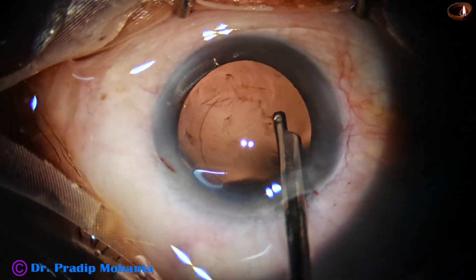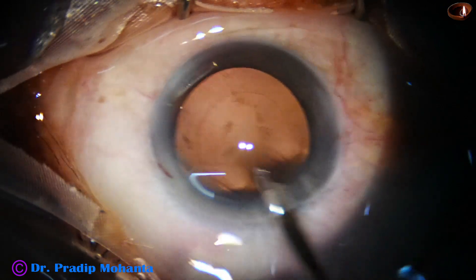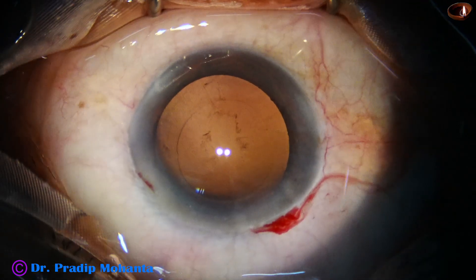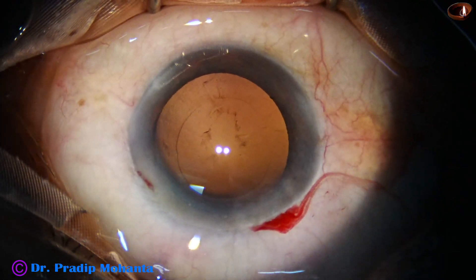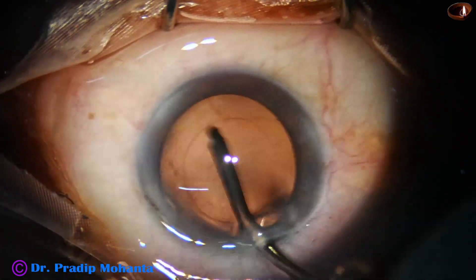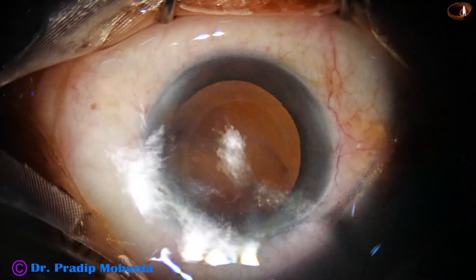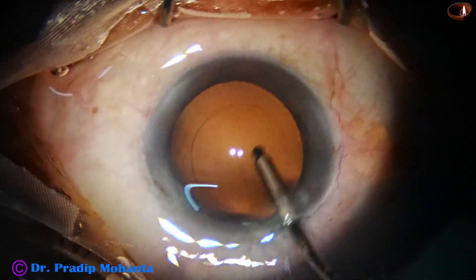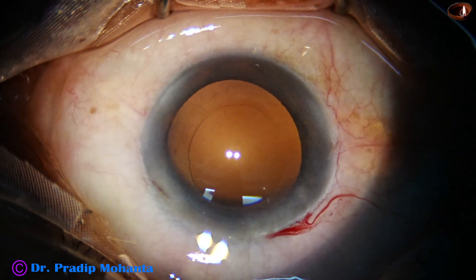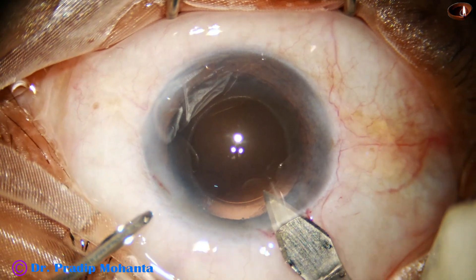I try to remove some cortex from the posterior capsule, but the safer option is hydro polish. In hydro polish, you are just using the irrigating fluid, directing it towards the posterior capsule and sweeping to and fro, from side to side over the posterior capsule. And see — all the lens matter and lens cells that were sticking to the posterior capsule have gone.